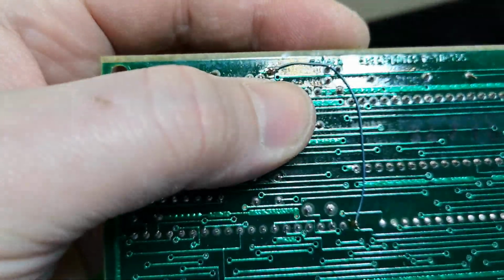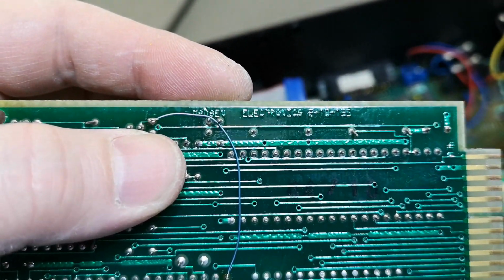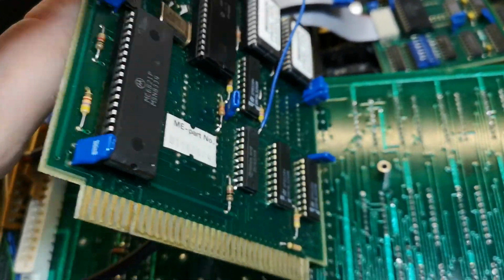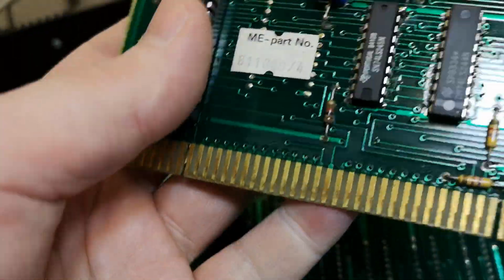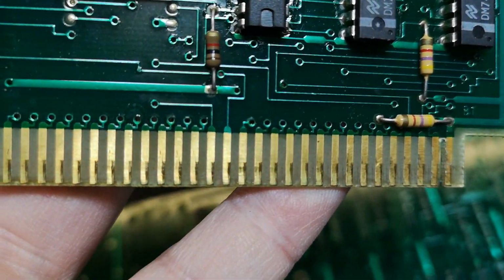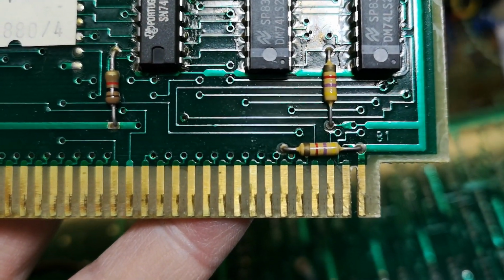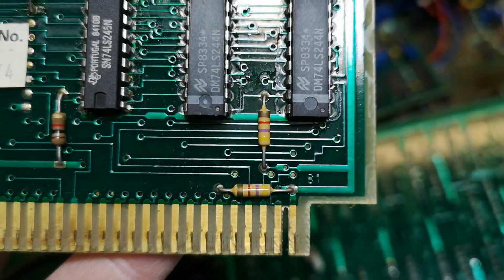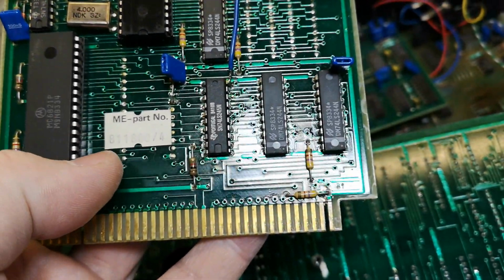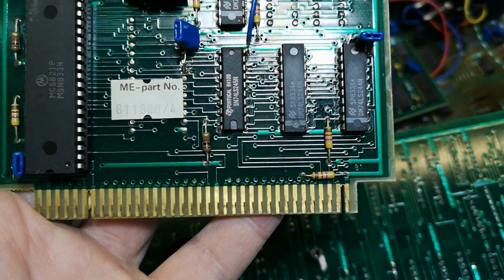Very, very smart. I actually saw some funny layout stuff I wanted to show you. Oops. Look at that. Isn't that funny? How the track goes into the first via. Well. I will try and clean the contacts here and see if I can get it any better.